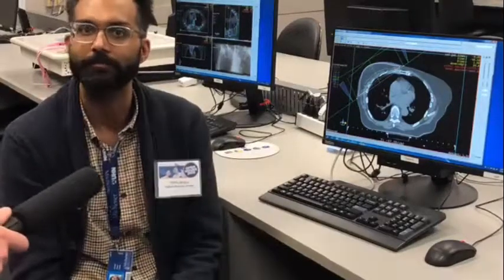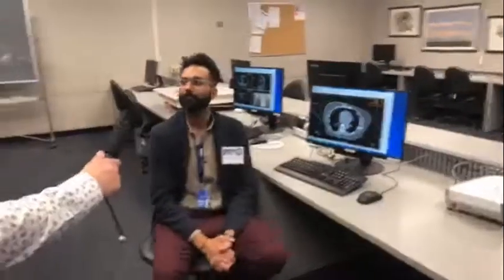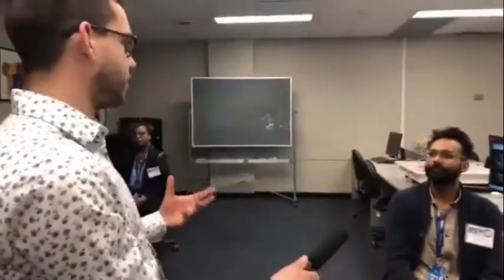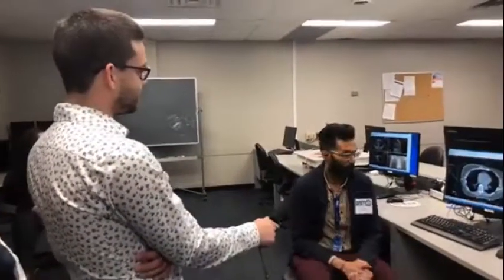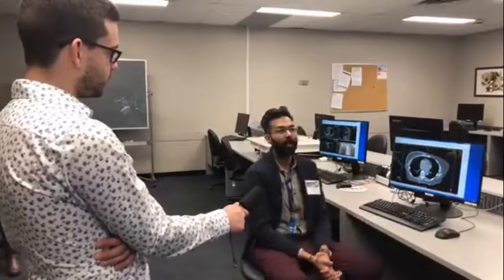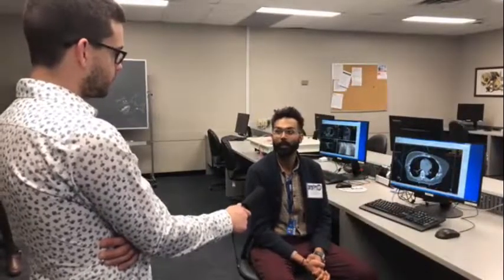Amazing. So in terms of program delivery, for your students, what's different or what is special about your delivery, and how do you teach these things? Well, it's the fact that we could simulate what's going to happen at clinic. So this is actually exactly what a therapist would be doing in clinic.